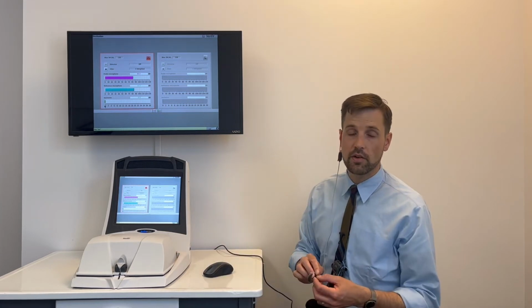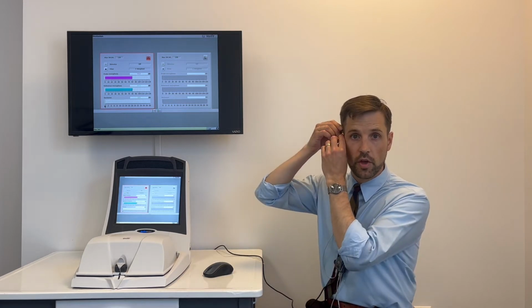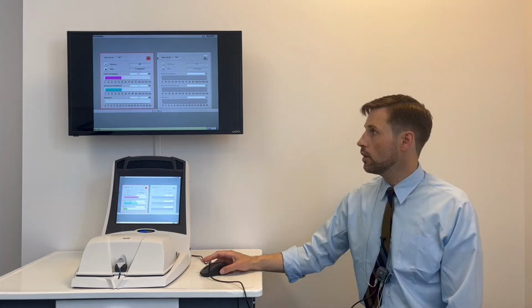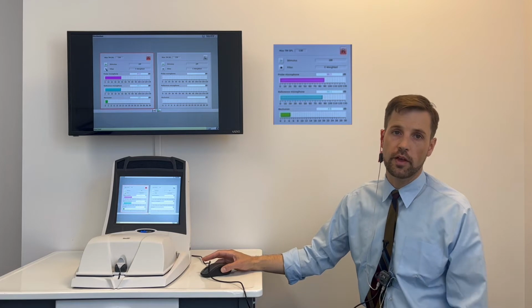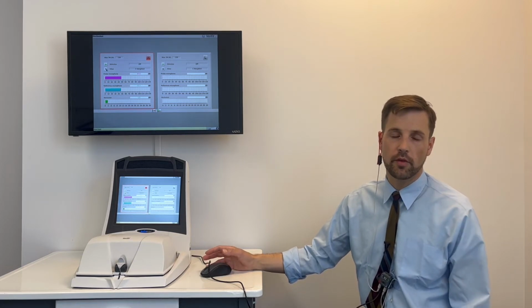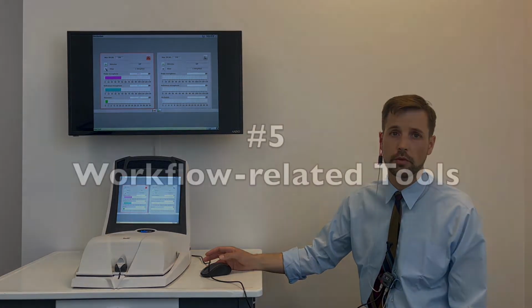But if I take a hearing aid, muted of course, because we just want to know what the acoustic effects of the coupling itself are, with a power dome on it, what you can see is that the occlusion value is significantly higher. It's about 4 dB. So that's suggesting that I'm not fully blocking off the ear. There's still some leakage, but there's definitely more occlusion than just with an open dome.